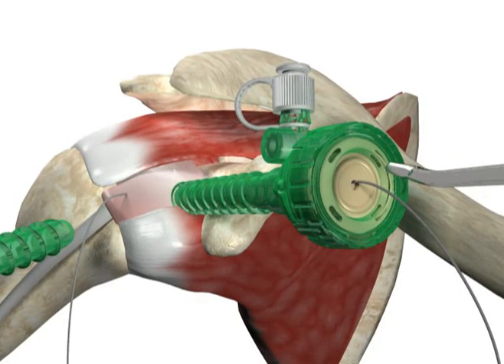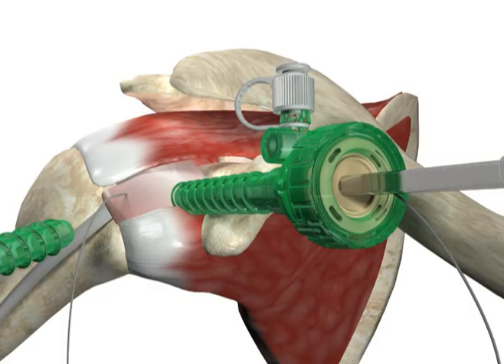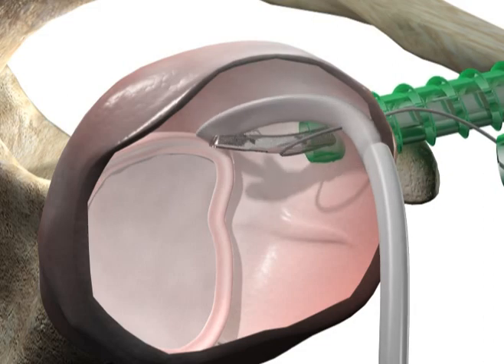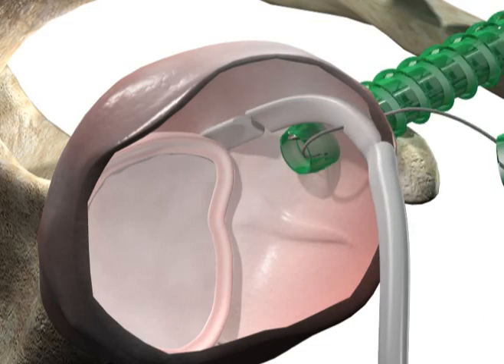Accessing the joint through the anterior interval portal, use a basket punch or arthroscopic scissors to cut the long head of the biceps tendon at its insertion point onto the labrum. Debride any bicep stump that remains.